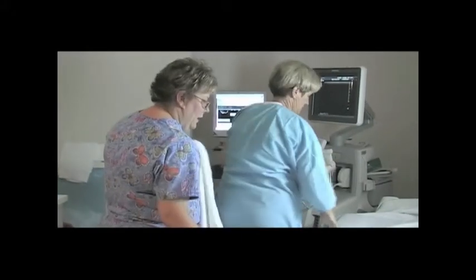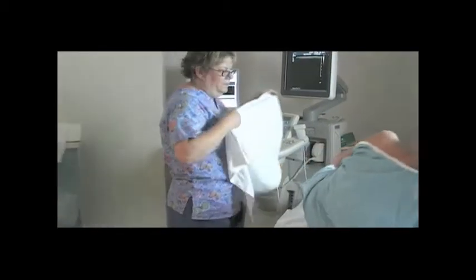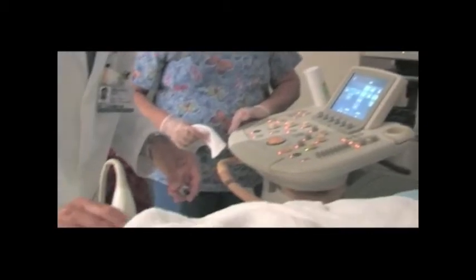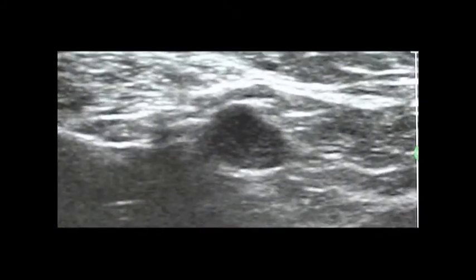To begin the ultrasound-guided breast biopsy procedure, position the patient lying on her back on the exam table. Begin the preliminary scan that will identify the target lesion. Once the area of interest has been identified and confirmed, the patient can be prepared for biopsy.